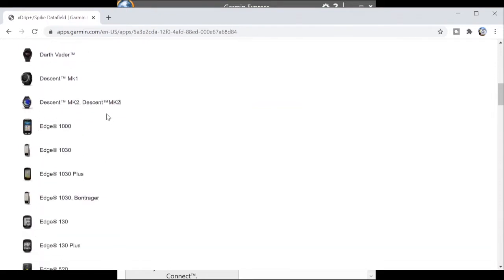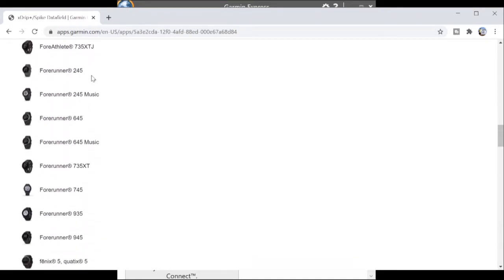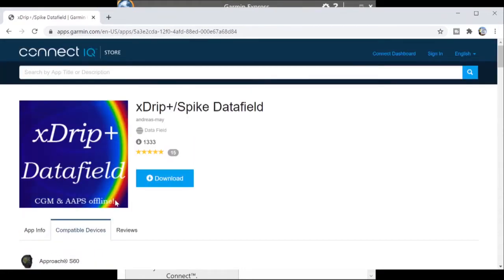You can check a list of all compatible devices to make sure yours is there. It's got all the Edge devices — which are the cycling computers — and all the different Forerunners. The one I'm using at the minute is the 735XT. Then simply click the download button and it will download into your Garmin Connect app.